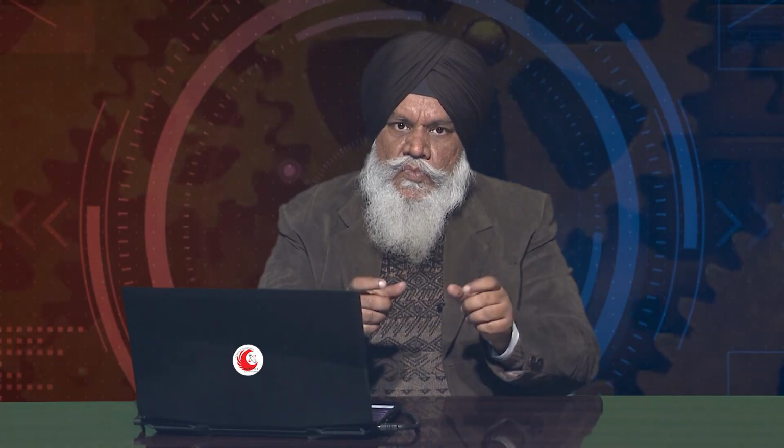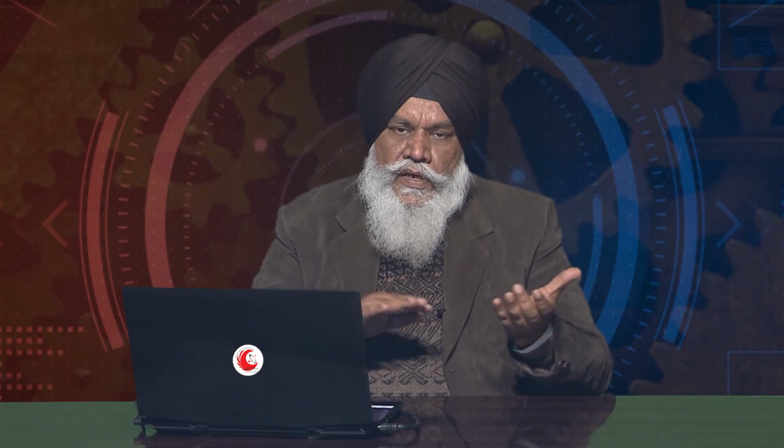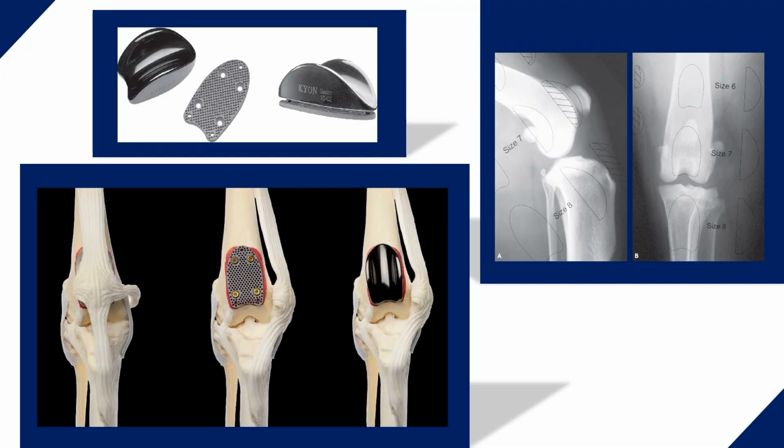So basically, because of the movement of the patella, we have to fix it using some cage. We have developed this cage in our lab, and finally the assembly ensures easy movement of the patella in the trochlear groove of the bone. From a typical mechanical engineer's perspective, this is just like a slider crank mechanism. So I have to design a slider in a particular race in which it is moving, and there is no sidewise movement. That has been one of the works in our lab.